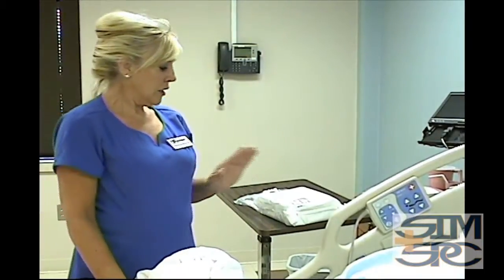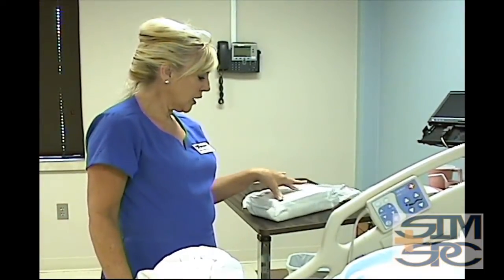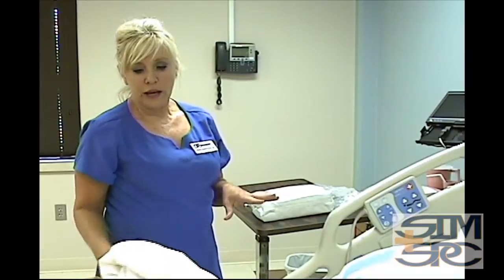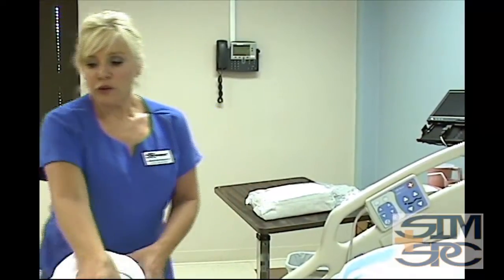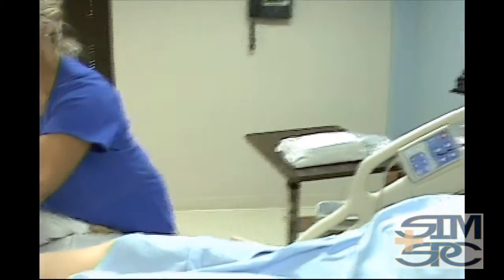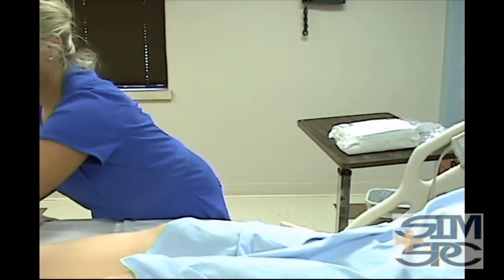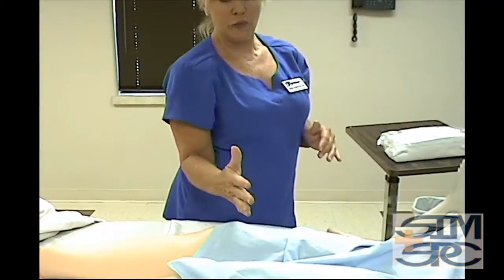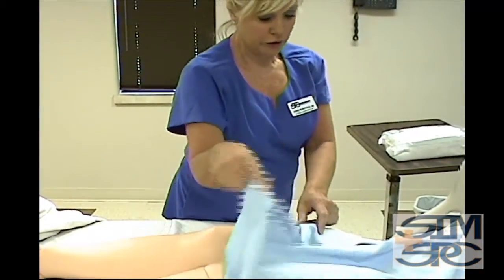Once that's done, you have your kit here. We've already checked that, and we've already explained to the patient. We're going to go ahead and get the patient ready for the catheter to be placed. If you do have towel drapes where you can drape the patient's legs, then you can do that. If not, I recommend going ahead because if you put the covers up and she moves, then the covers can fall back on your clean field or your sterile field.